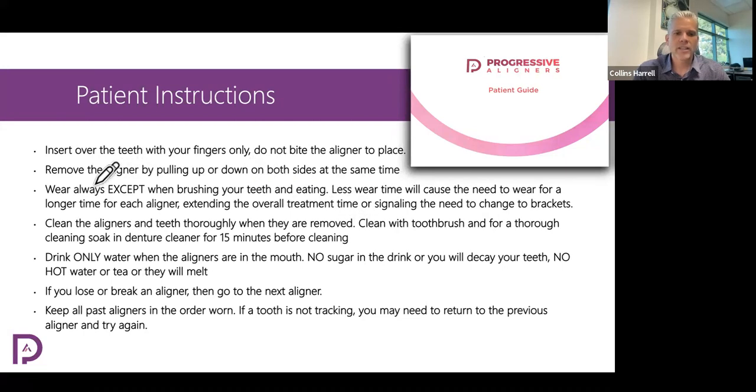Okay, so always wear the aligners except when you're brushing or eating. If they have their aligners out too much, it's going to make them have to wear them longer and treatment won't go as well. Okay, clean the aligners as we talked about.